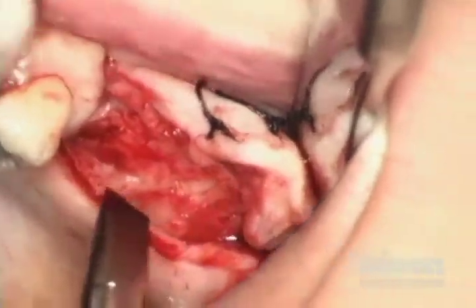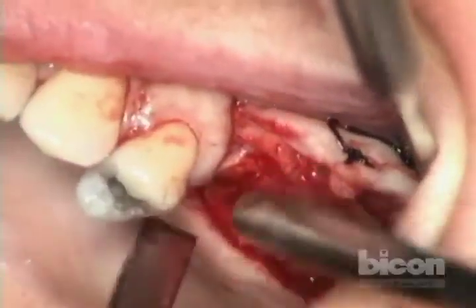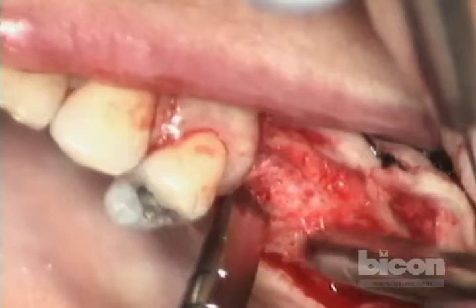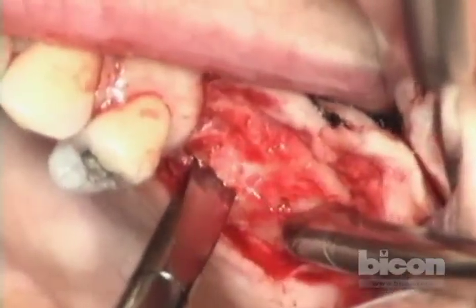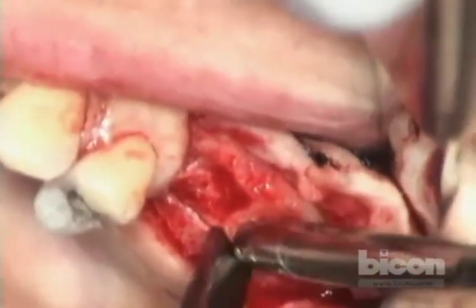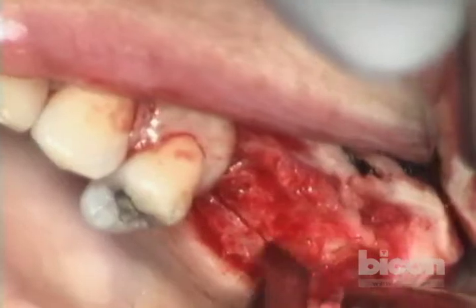Now we're going to make the connecting cuts between the two. These are the same osteotomes that we use for maxillary ridge splits. You can get fancier ones, but I think these work the best — they are sharp and available.